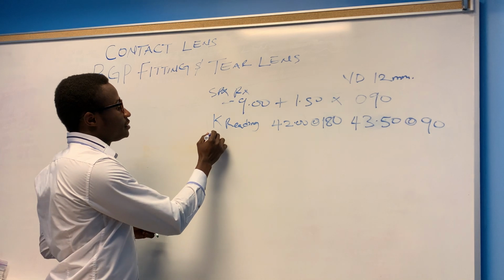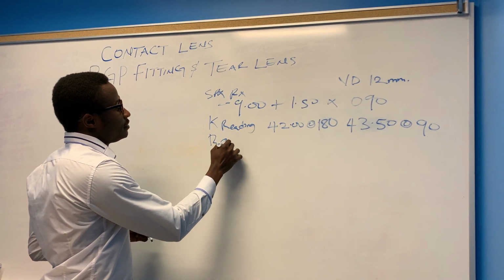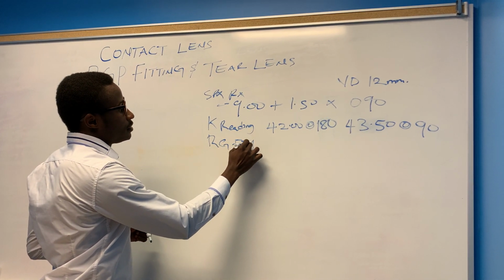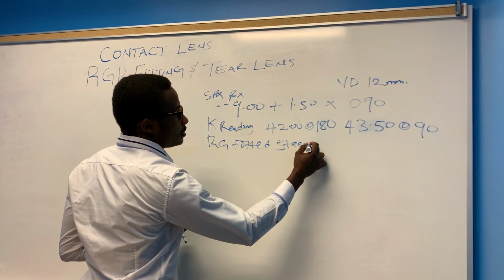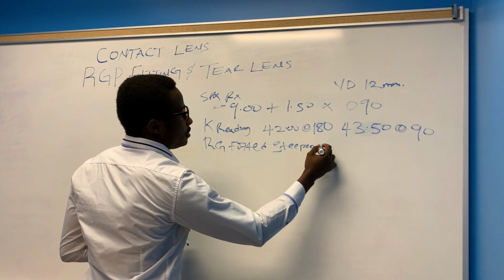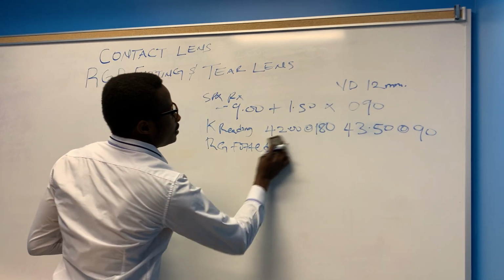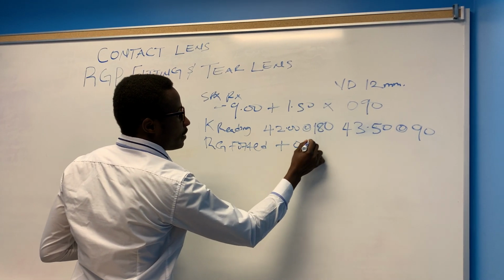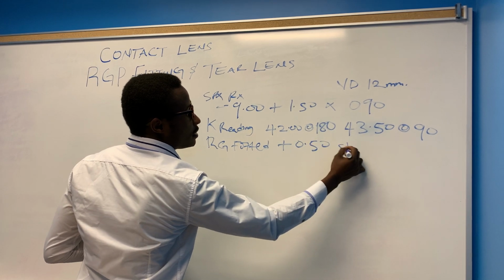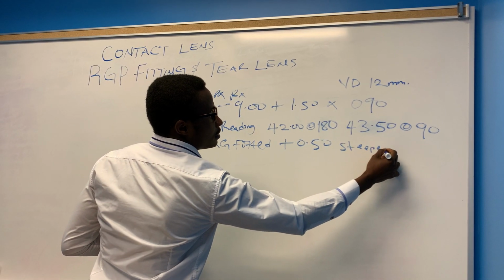The RGP lens is being fitted 0.50 steeper than K.